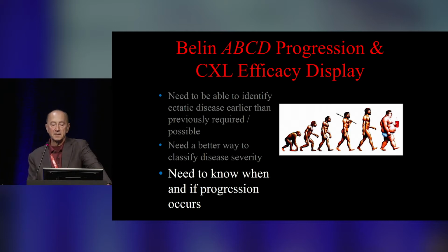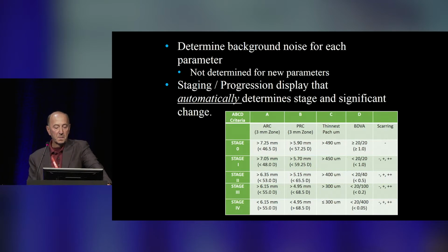It was really to take this and to be able to utilize it in a progression display. Because really, we need to know when and if true progression occurs. And to do that, we needed to know the actual background measurement noise of each of these parameters.